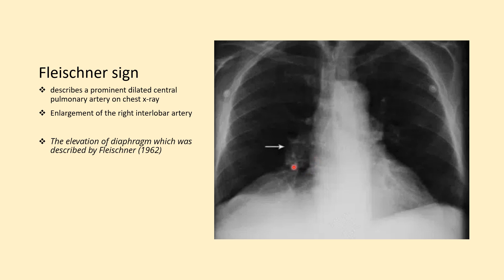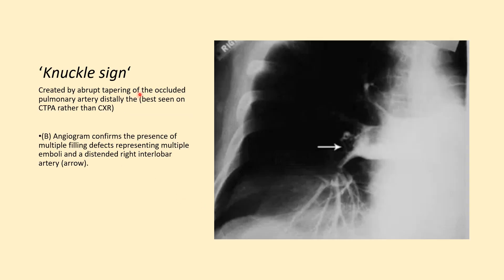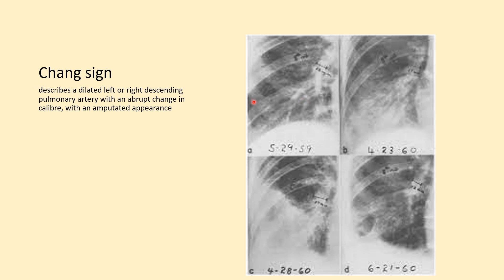This is an X-ray which shows a dilated central pulmonary artery. This is known as the Fleischner sign. Fleischner also described elevation of the hemidiaphragm, which was also a suggestive sign for pulmonary embolism. Another sign is the knuckle sign — when an embolism is lodged in the main pulmonary artery or the right interlobar artery, there is an abrupt tapering of the artery distally. This is known as the knuckle sign. The Chang sign is a combination of the knuckle sign and the Fleischner sign, in which there is a dilated pulmonary artery followed by abrupt tapering distally.